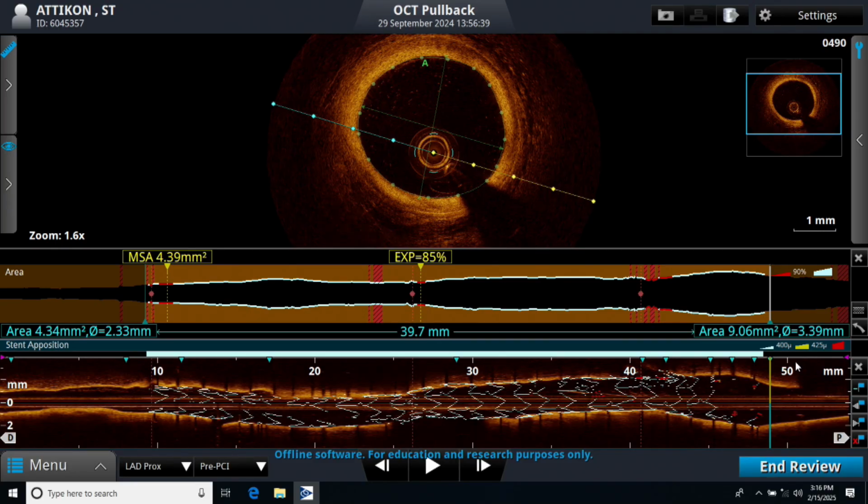Dejan, that was great, because you could basically see that there is this oval shape of the stent, which is pushed from one side of the vessel wall to the other, which I think is the result of the first wire being a few millimeters abluminal at the beginning. And this is what I think is an important message. If we have a stent failure event, then you need to think already in front that this is most likely a result, or could be a result, of a mechanical problem.